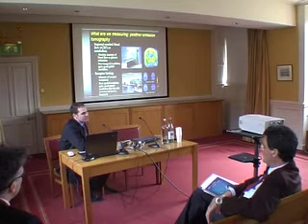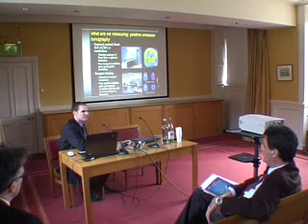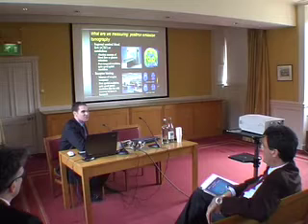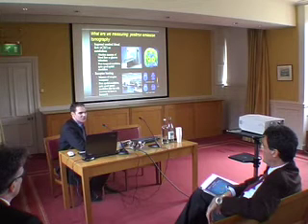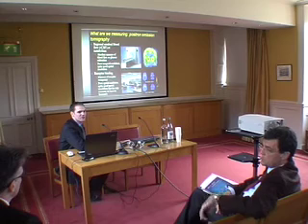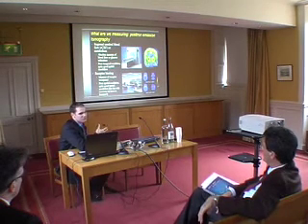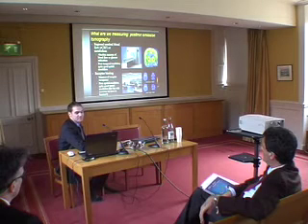But in particular, they have very poor temporal resolution. So you need to collect data over several minutes in order to get a good idea of the signal that you're trying to measure. And of course, in psychological studies, when we're trying to change the task demands over a short period of time, that presented us with some difficulties. So the kinds of experiments that you could do were limited by this ability to measure the signal quickly.